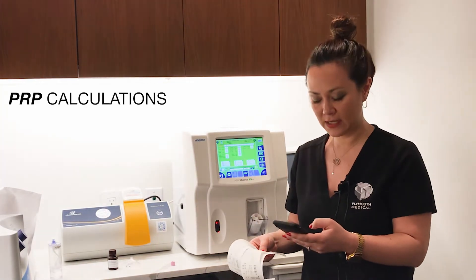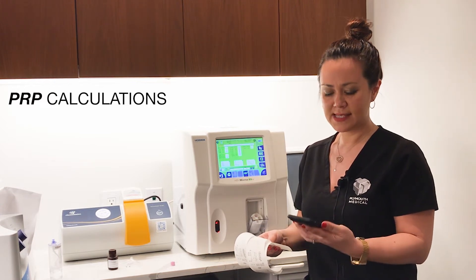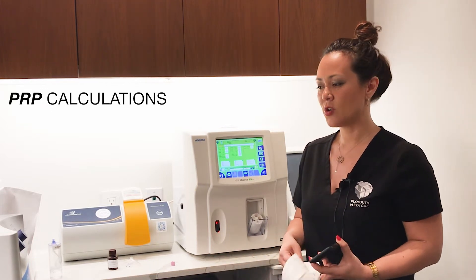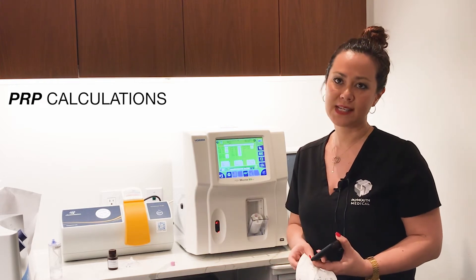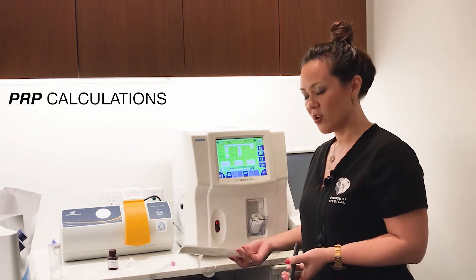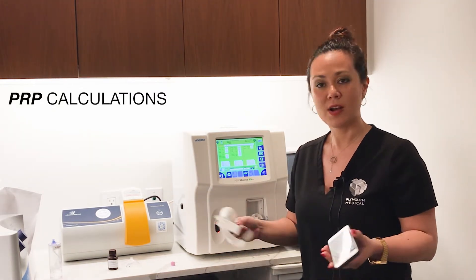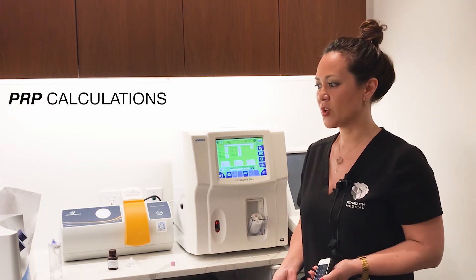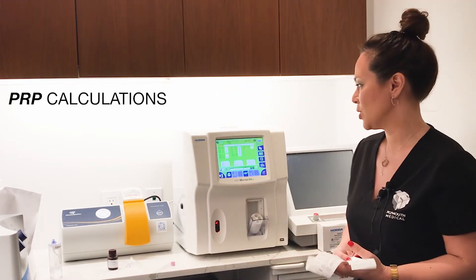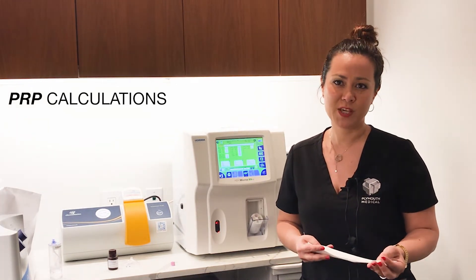I'm going to take the final platelet value in the PRP and divide it by the average baseline levels and see that it's a seven-time concentration on this sample. The salient points here are that we started with 60 mLs of anticoagulated blood — so 6 mLs of anticoagulant sodium citrate and 54 mLs of whole blood — which we characterize to have a baseline of roughly 220,000 platelets per microliter. Then we processed protocol A, which is a neutrophil-poor PRP.